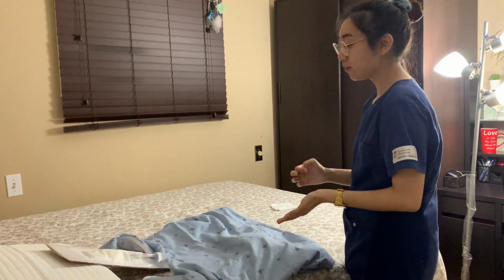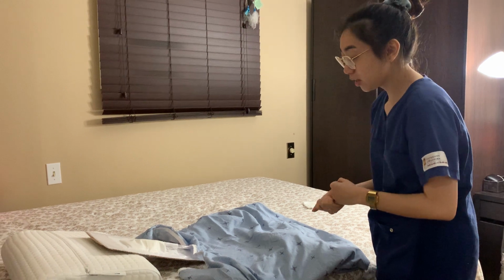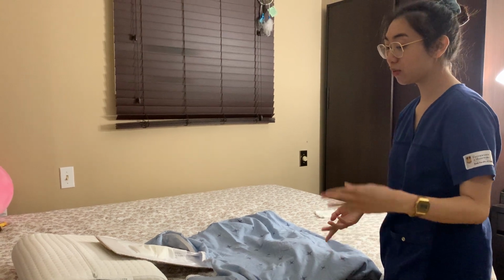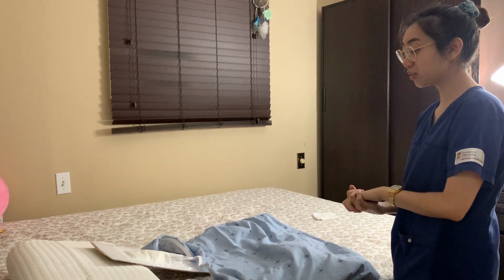Miss Linda, you do have a chest tube, and today I'm going to be changing the dressing for it. So I'm going to be removing the old dressing. I'm going to clean the wound. I'm going to clean the site, assess the site, and I'm also going to put in a new dressing, which I have here. Do you have any questions for me? No? And are you still okay to receive this procedure?